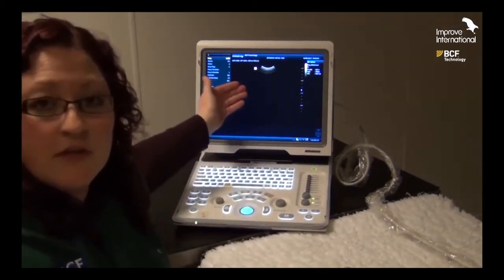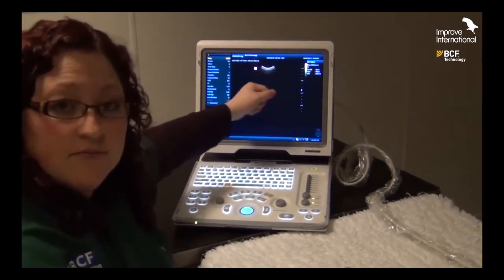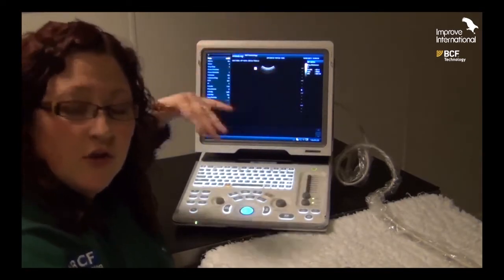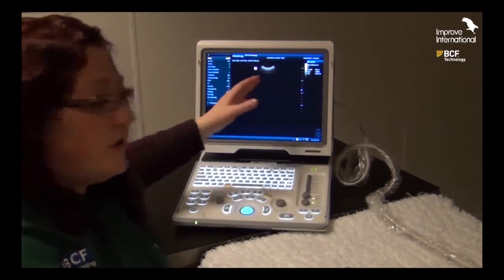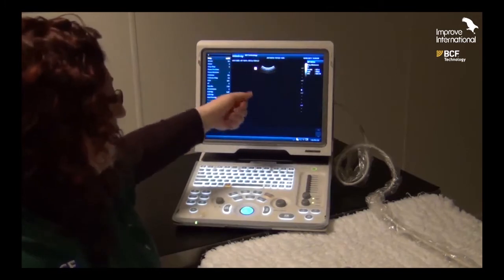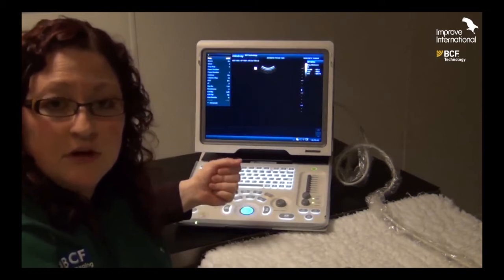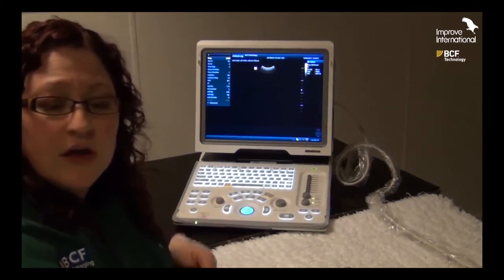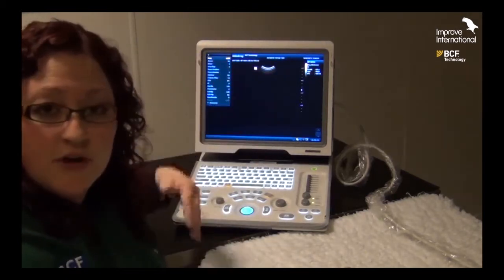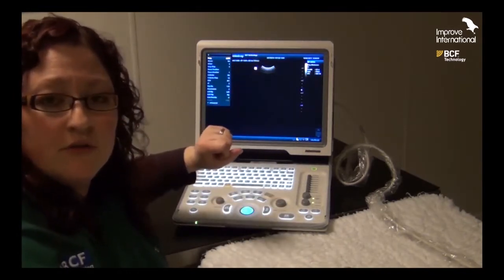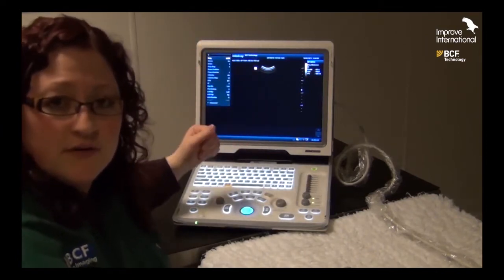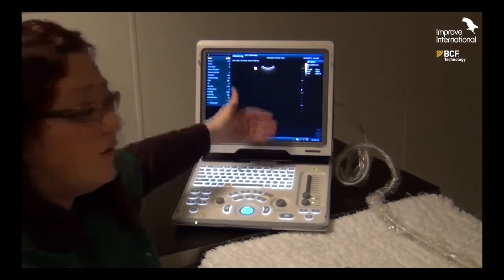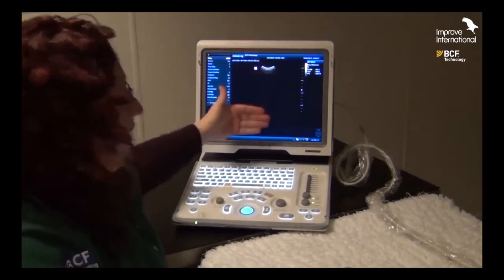If we are looking at something very superficial, such as a kidney, and we're not expecting the wave to penetrate very deeply, then we can use an increased or higher frequency in combination with a decreased depth. On this particular screen, for example, we may only be looking at five to six centimeters of depth, and therefore we could use a higher frequency setting. Conversely, if we have an increased depth setting, we'll need to decrease the frequency setting so that we improve penetration and have a nice image all the way from superficial structures down to deeper ones.